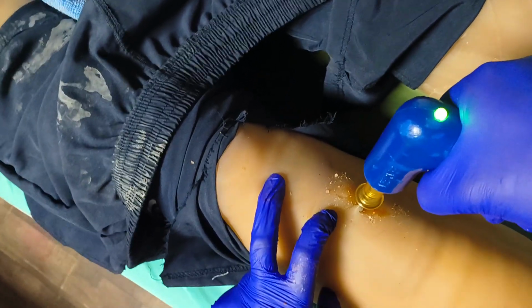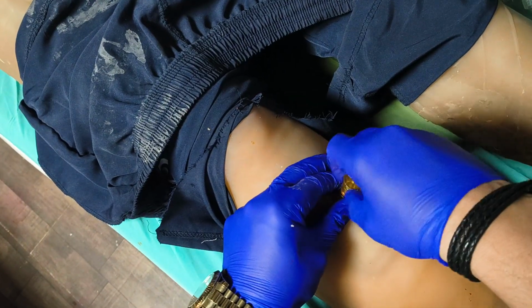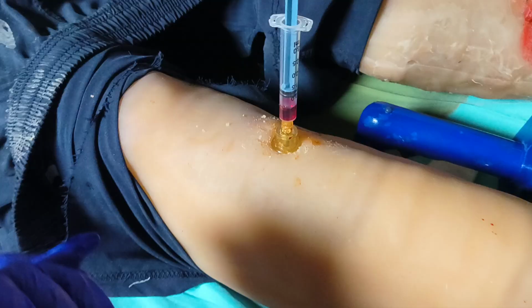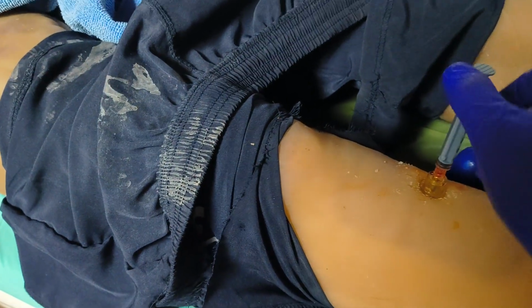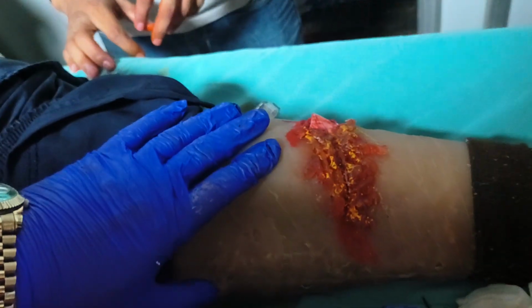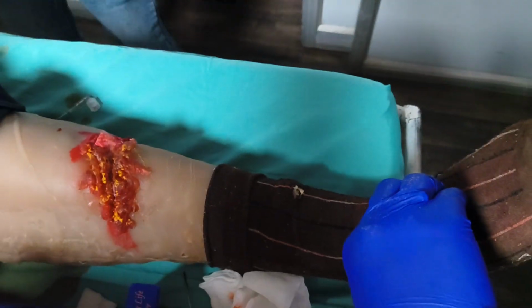Anteromedial surface. So you have to be careful. If the patient is obese, use the yellow needle. Otherwise, you can use the blue needle in an adult, and up to 40 kg you have to use the red needle. Okay, so you can do IO access, or now you can do splinting of the fracture, and DPA is palpable. You can nicely feel the DPA that is there.